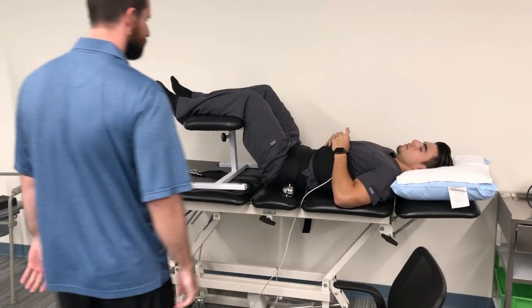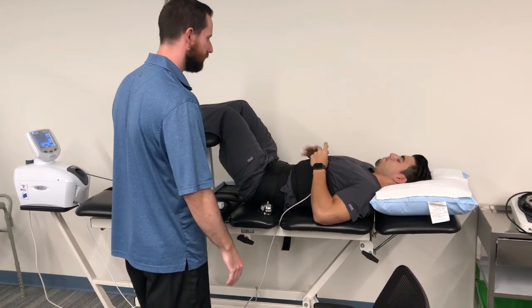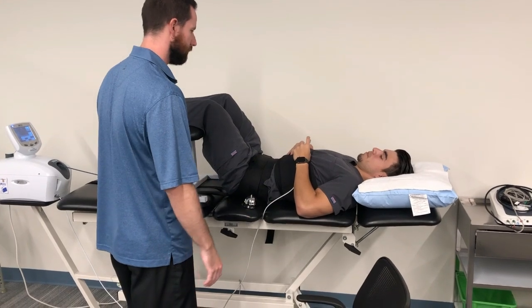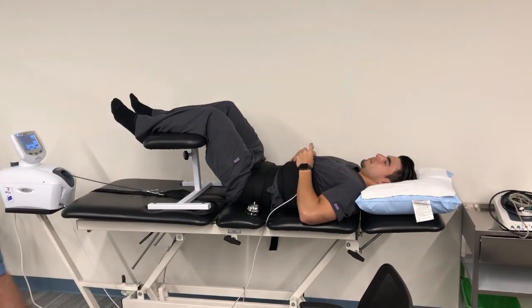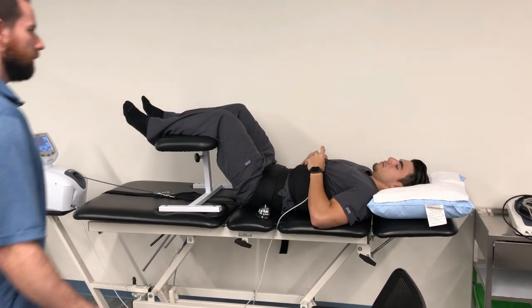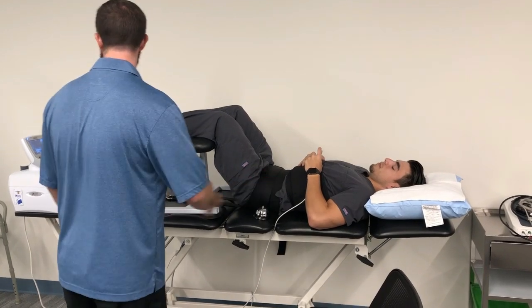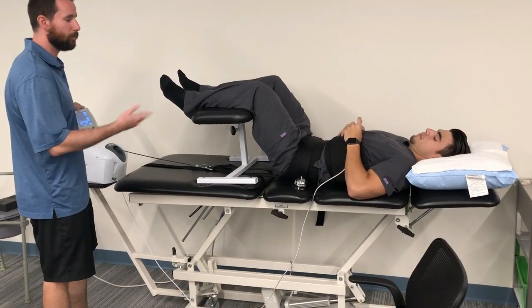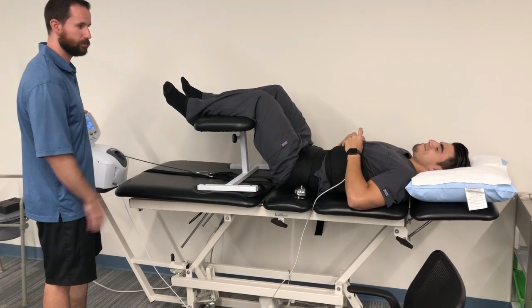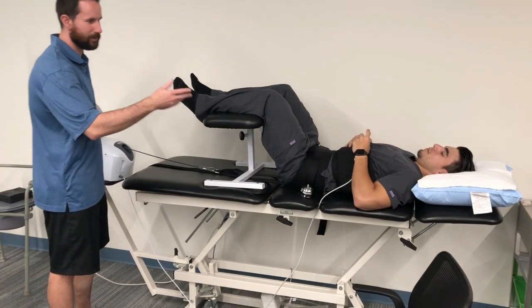Okay, it's been 5 minutes. So how are you feeling? Feeling good? You're not having any pain, anything out of the ordinary? Nope. Okay, so we'll go ahead and do this for another 10 minutes. Okay, and so that was a total of 15 minutes. I forgot to mention to you that the pulling weight was about 1/3 of your body weight, which was about 60 pounds, because you weigh about 180 pounds.